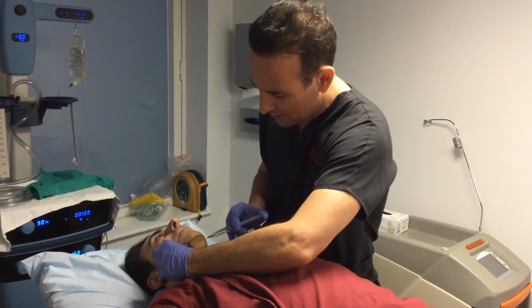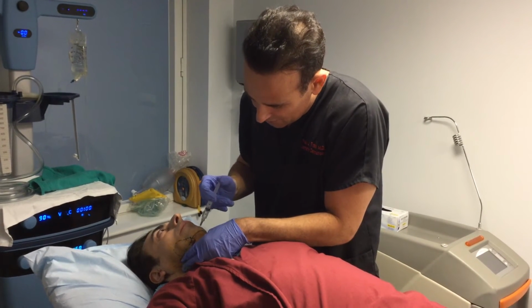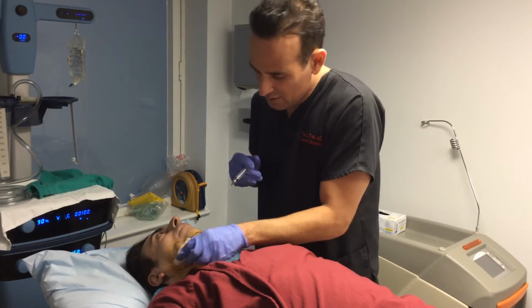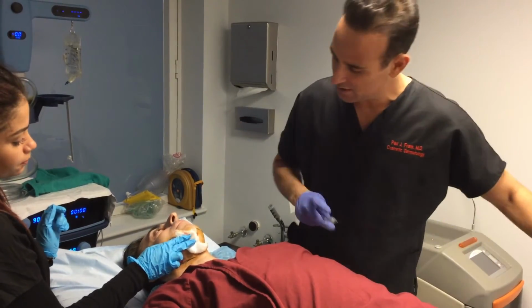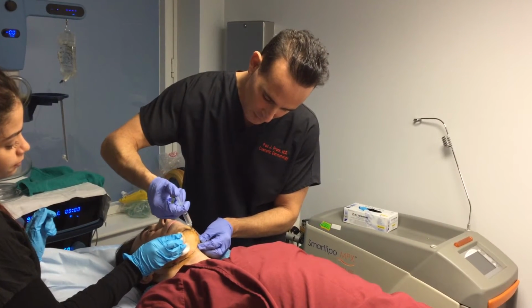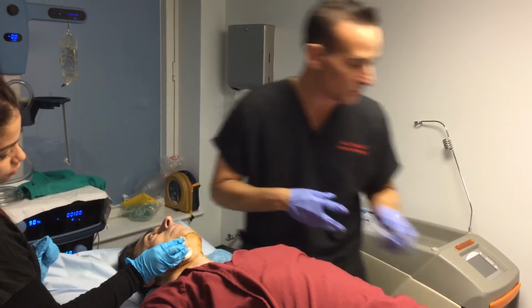I have to get into the jowl area. You may not be able to see all of this. But again, this is just local anesthesia. Okay, Megan, right there. And then we're just going to do this for a minute or two, and he will sit for about 15 minutes before we get started. I want him totally comfortable and totally numb. And after that, it should be a totally bloodless procedure.